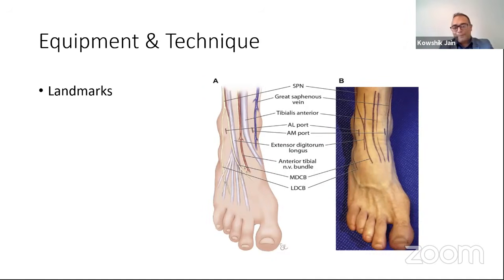Right, so this is interesting. To perform ankle arthroscopy safely, it is mandatory that we know the structures which go around the anterior aspect of the ankle. We have to have sufficient knowledge of the tendons which cross the ankle joint, the nerves and the vessels, so that we stay out of harm's way and don't damage them, which can easily happen during this procedure. That way, it is actually much riskier than performing a knee scope.